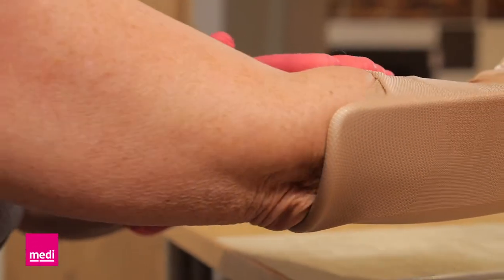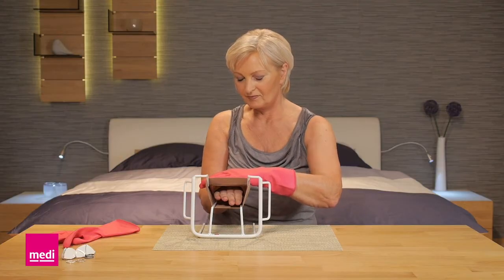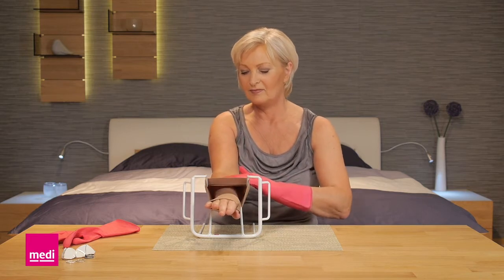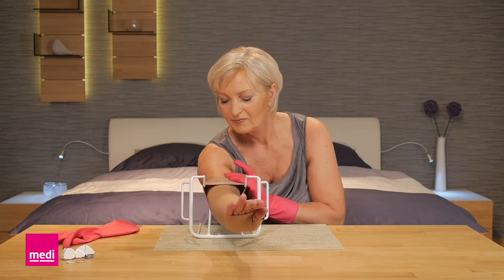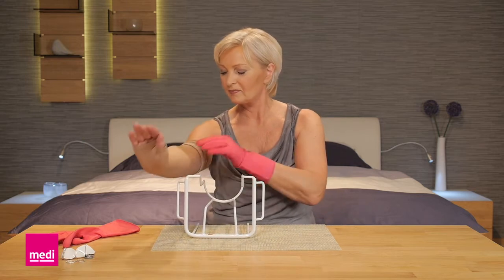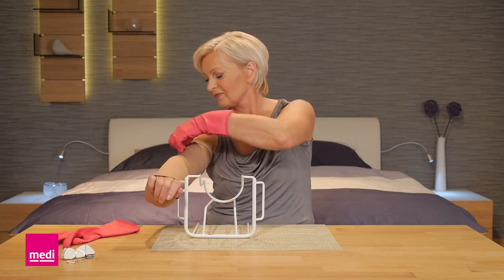Your elbow should lie comfortably by your side and the palm of your hand should be facing the table. With your other hand, pull the arm sleeve gently towards you. Once the lower cuff of the arm sleeve is properly fitted, for example at your wrist, push your arm slowly and evenly into the arm sleeve as far as you can. Make sure that you keep your arm straight — with the back of your hand facing upwards, your elbow by your side and the palm of your hand facing downward.